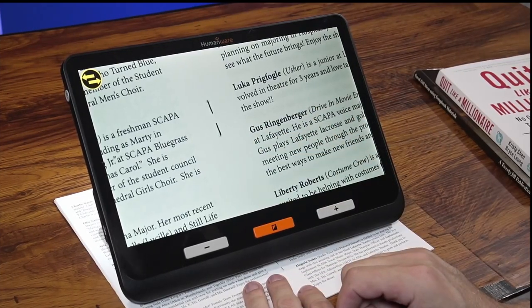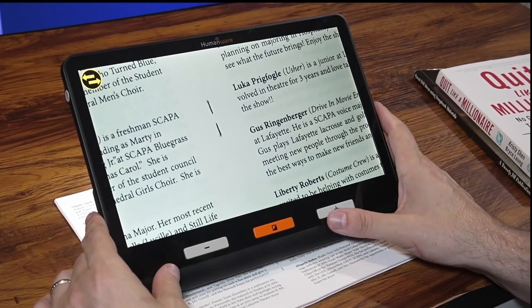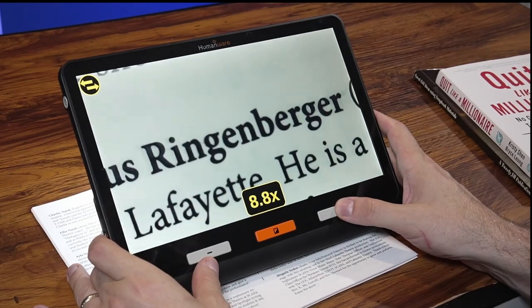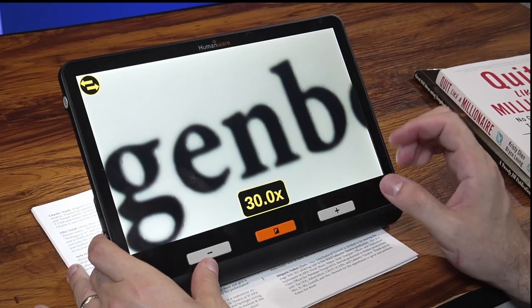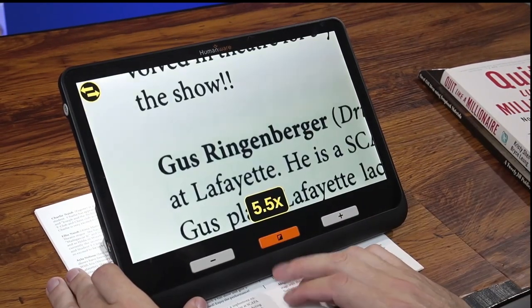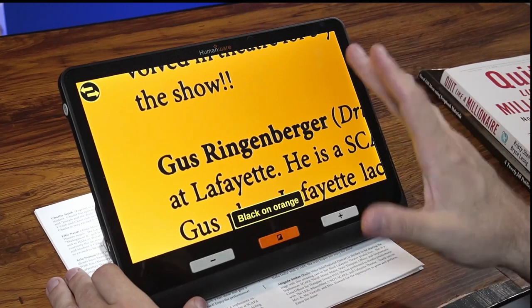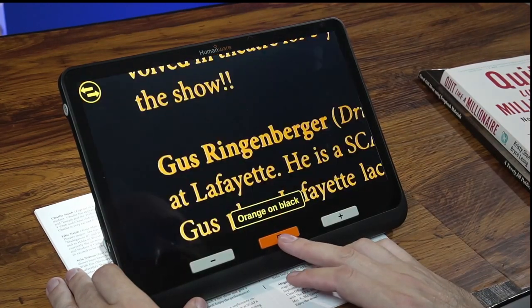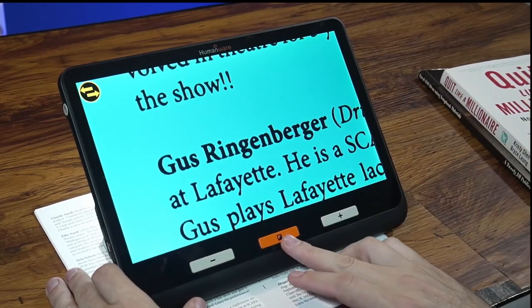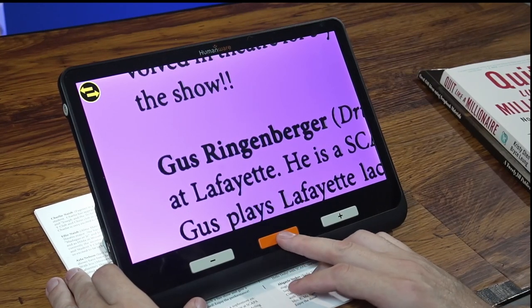Now we're looking at some text through the Explore 12. Using the front hardware buttons, we can zoom in and zoom out. Zoom ranges all the way from 2x magnification up to 30x. We also have our color filter button, and we can cycle through about 15 or 16 different color options, including full color and some unique colors like pink and light blue that you don't see on other digital video magnifiers.